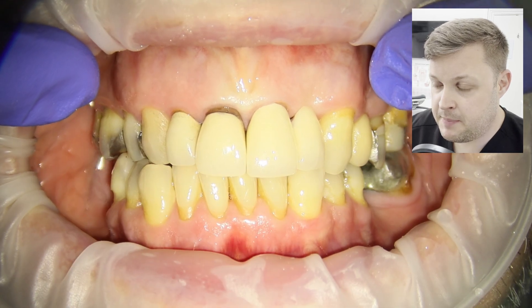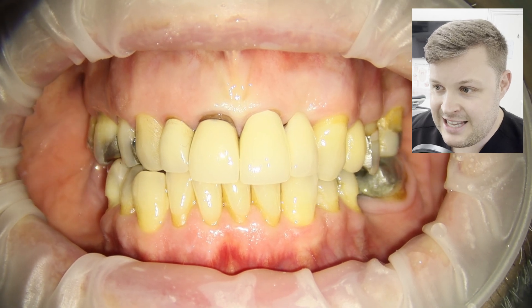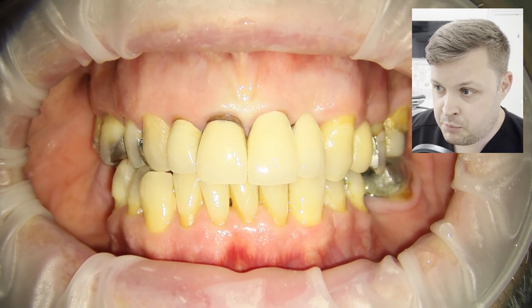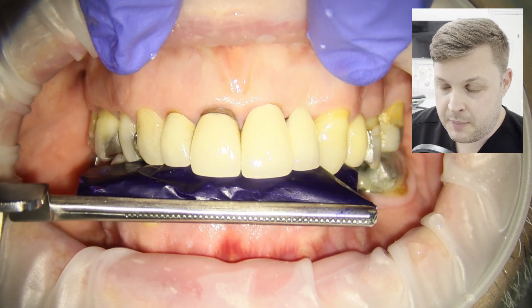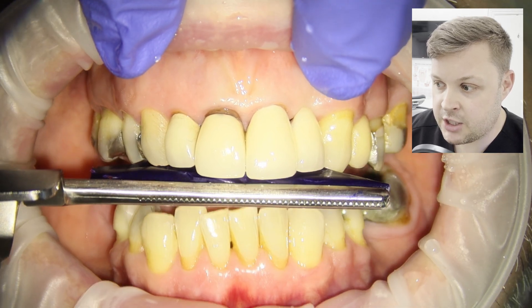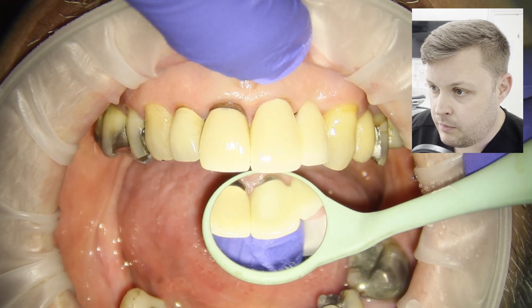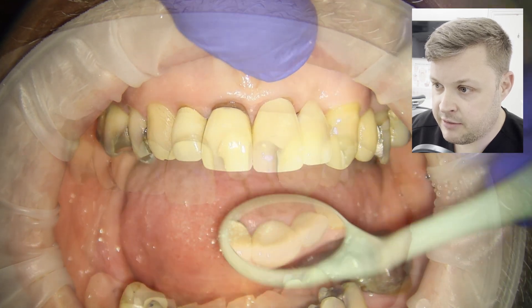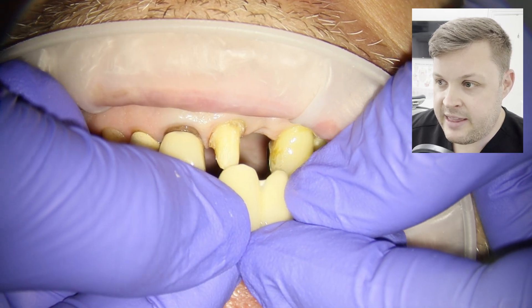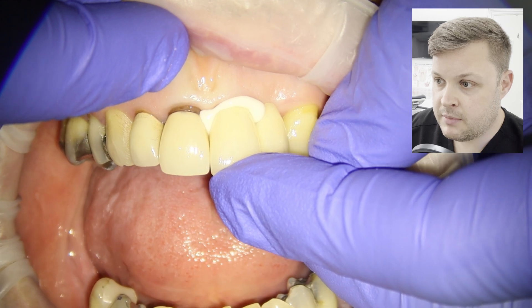We place the final bridge in, get the patient to bite together — it looks nice and the patient feels the bite is pretty good. Even so, I want to check with articulating paper that the occlusion looks good. I also check the palatal aspect, and it looked pretty nice, so we're going to cement the bridge with Ketac Cem.